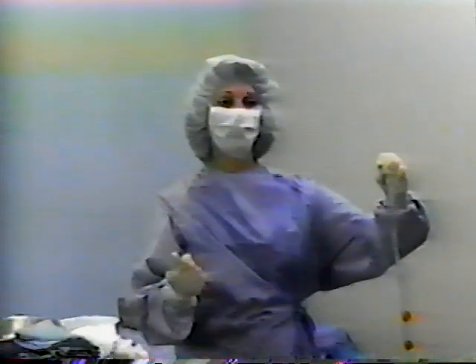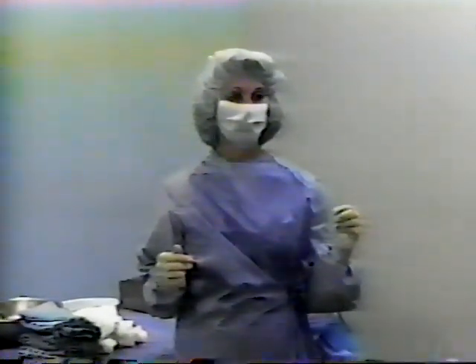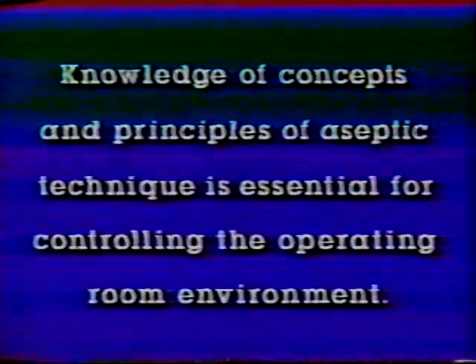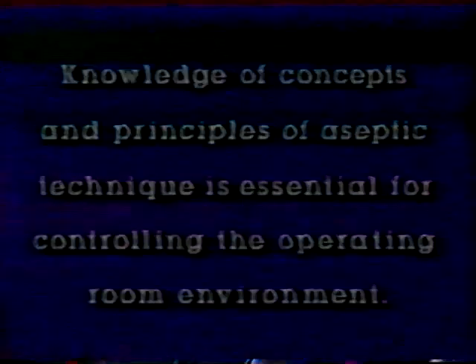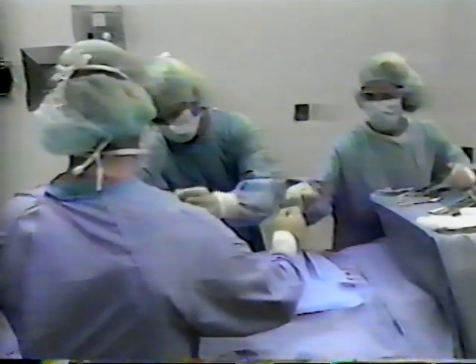The person with a good surgical conscience must also have self-discipline, good anticipatory skills, and the maturity to perform correctly in every situation. Knowledge of concepts and principles of aseptic technique is essential for controlling the operating room environment. There are 8 principles of aseptic or sterile technique.